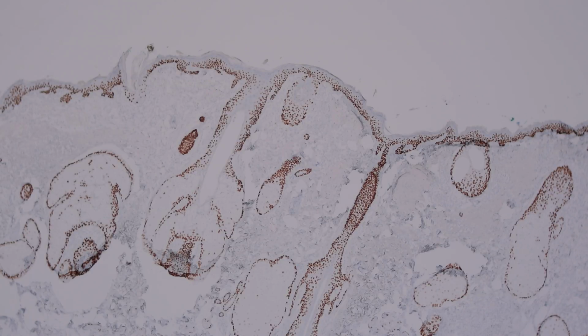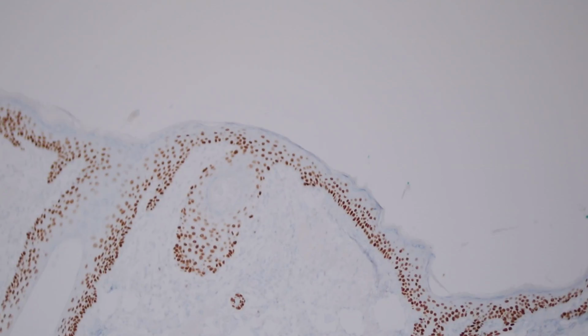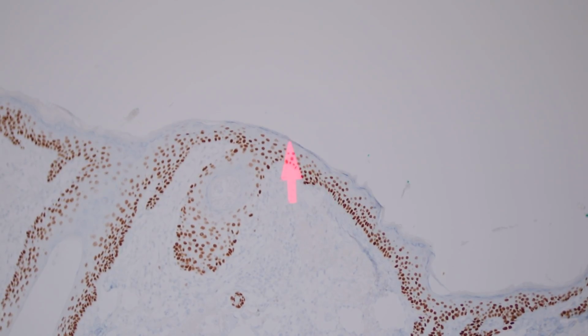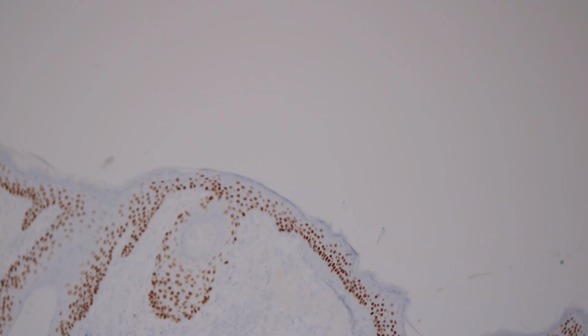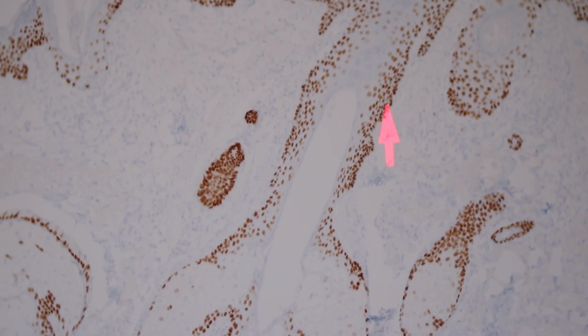Okay, so this stain right here is p63. p63 is a nuclear stain that stains keratinocytes. So you can see beautiful nuclear staining here of the keratinocytes. And it also stains the nuclei of a lot of other adnexal structures in the skin. So it stains the hair follicle epithelial cells, which are closely related to keratinocytes at this portion of the follicle.